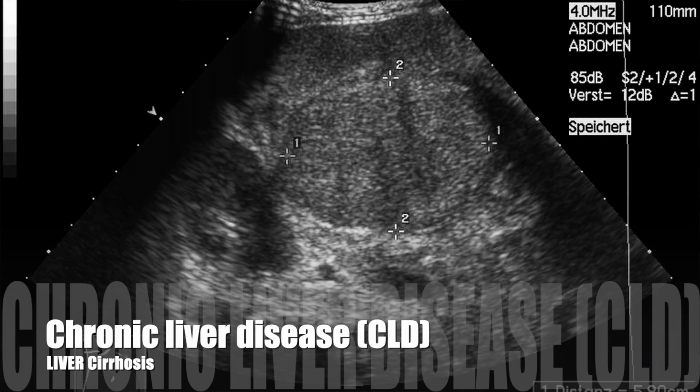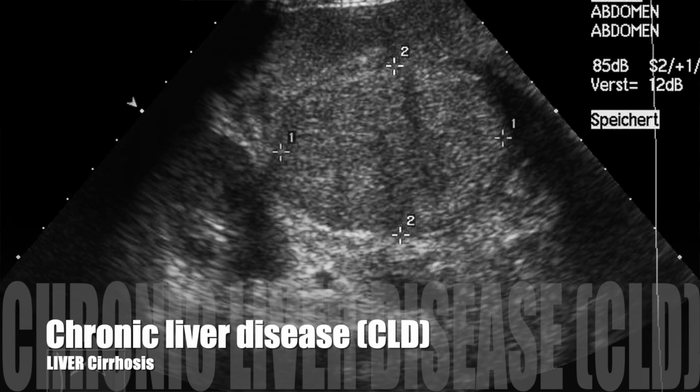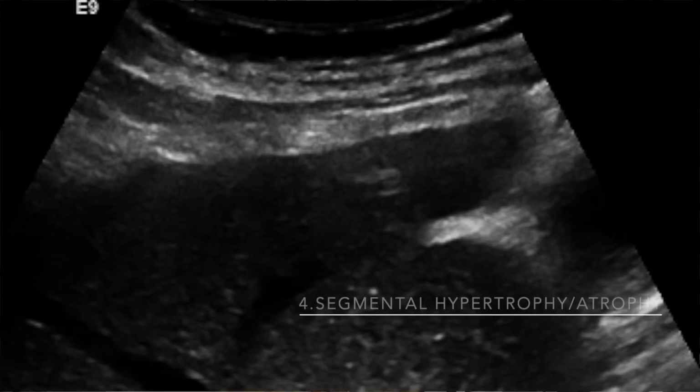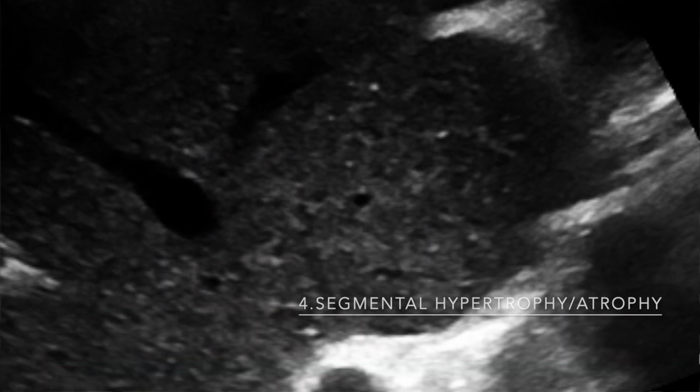Chronic liver disease. Now let's talk about the ultrasound features of chronic liver disease or liver cirrhosis, CLD. Number 1, decrease in the size of the liver, as in a shrunken liver. Number 2 is the surface nodularity or the irregular outline. Number 3, coarse or heterogeneous echotexture. Number 4, there may be segmental hypertrophy or atrophy.